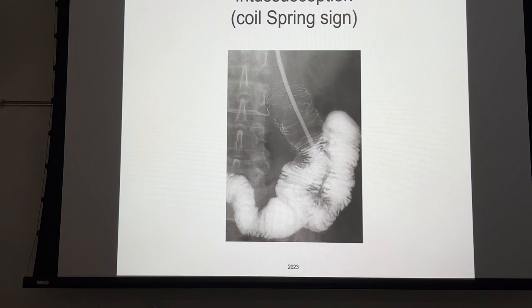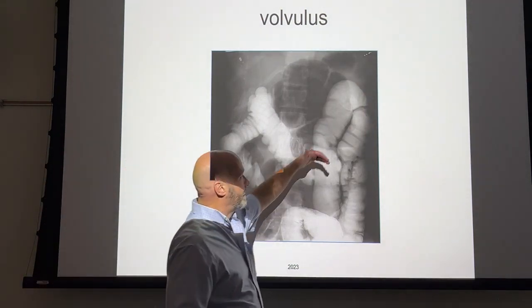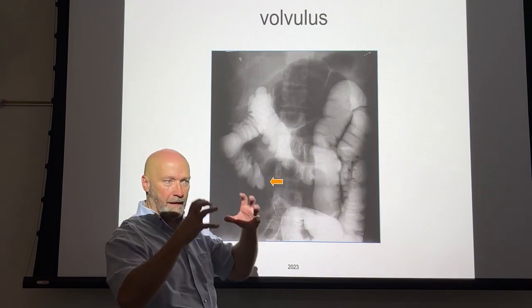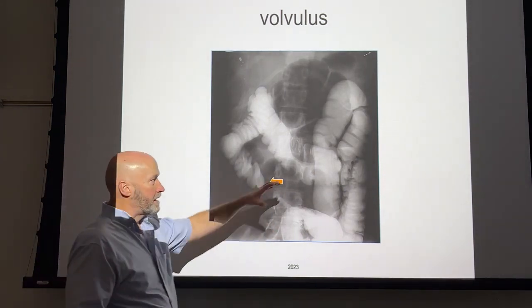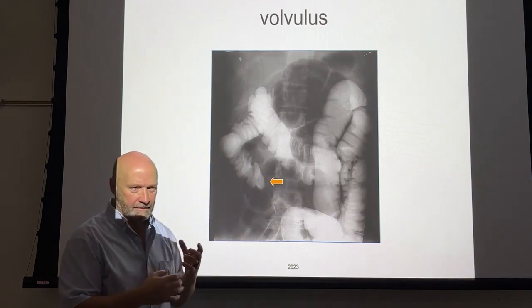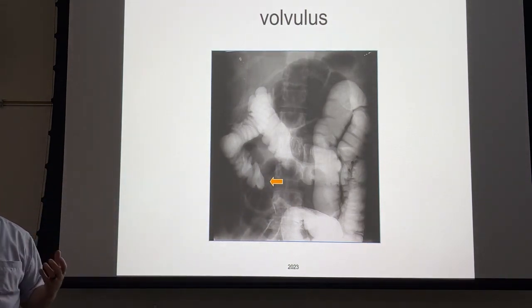Colitis. In a lot of cases with colitis in the large bowel, you normally see the haustral markings, the big clumpy pouches, looks like the Marshmallow Man, Michelin Man, whatever, right? With colitis, you get a loss of that, and some references will call it a stovepipe colon.